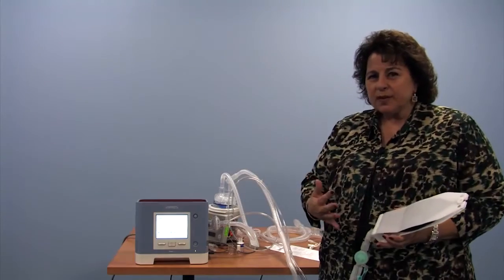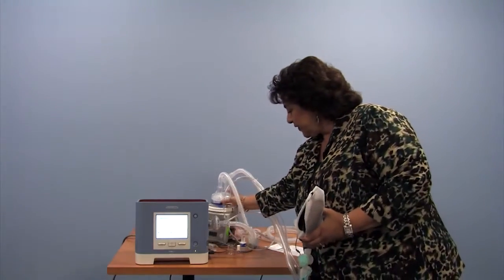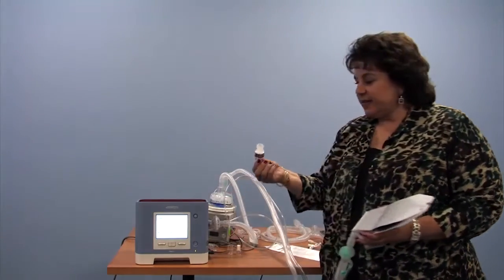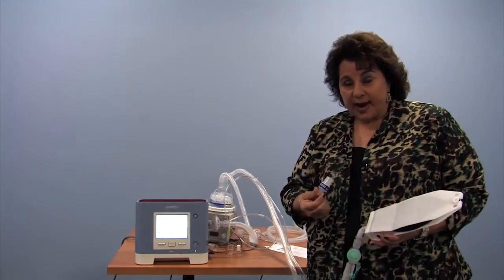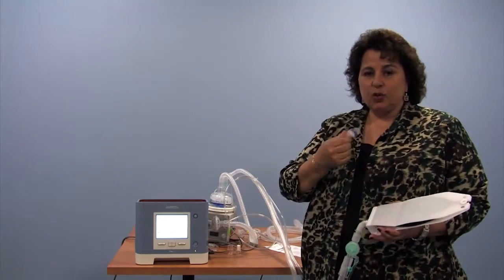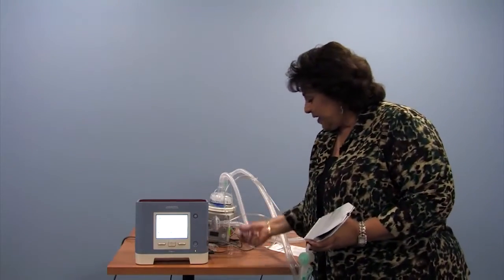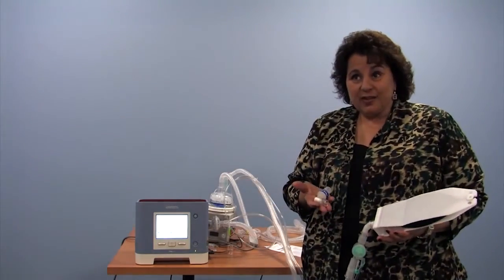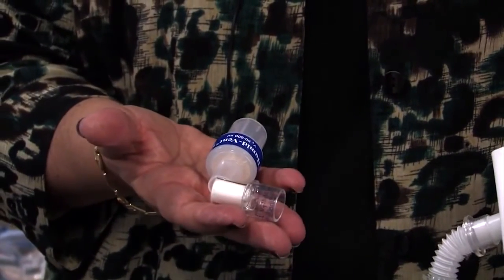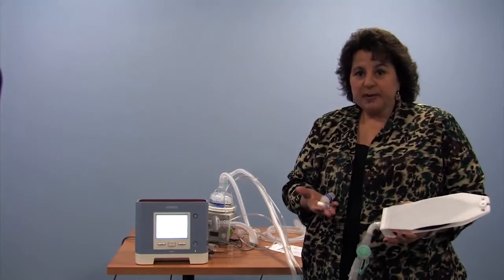In the adult world, very few use the heated humidifier system that you see here today. They tend to use devices like this one, which is called a heat moisture exchanger, and this captures moisture of the air that you exhale and attempts to give the heat and the moisture that it's captured back to you on the next breath. This is used in children. We have a couple different sizes depending on the size of your child and their breath. These are used in children when you leave the home and go out for the park, medical appointments, etc.